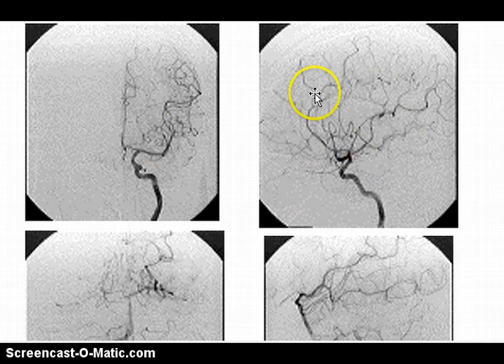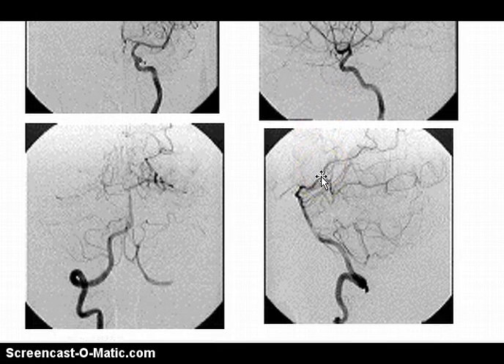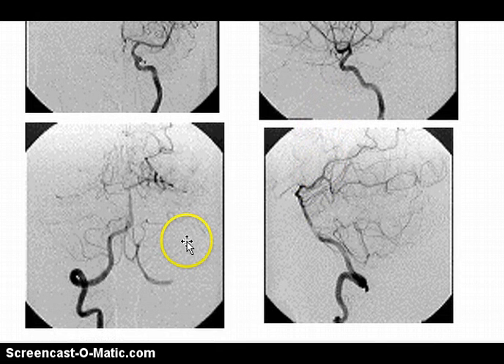And then this is the lateral view of the internal carotid. Again, you can see it come up, it has the carotid siphon, and then again bifurcates. And then I have the vertebral arteries right below that as a comparison. Here, this is the right vertebral, and it joins briefly with the basilar and then bifurcates into right and left posterior cerebral. And I can tell that this one is the vertebral because it injects all of the brain. It's not just one side.